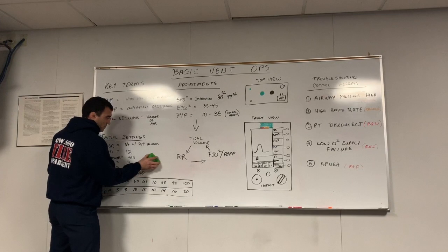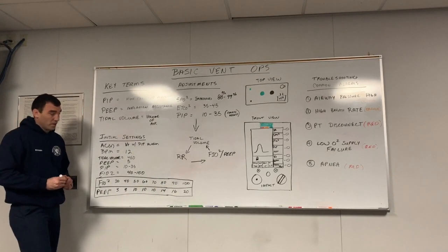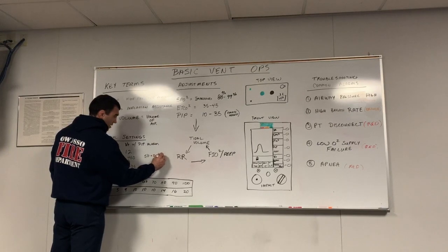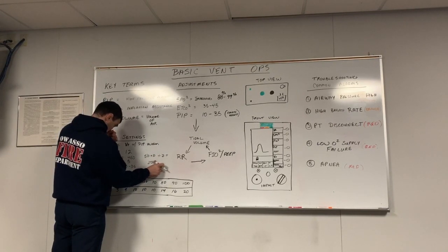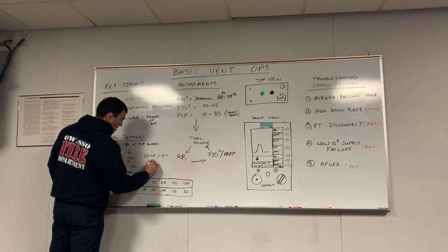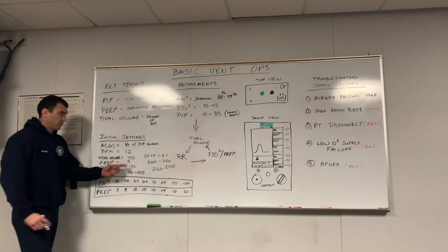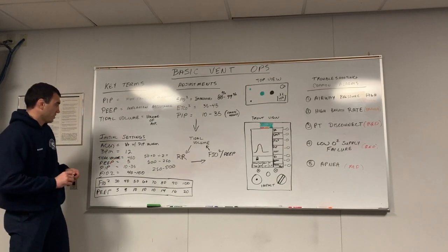Okay, so if we take the average elderly female that we run on a respiratory arrest, and she's 5 foot, we add our 0 and divide by 2, we get 250, or excuse me, can't add today. We get 500 to 250, right? So our range is 250 to 500. We're already starting on the very high side of that. So this will lead to a common alarm, and we'll talk about that in a minute.